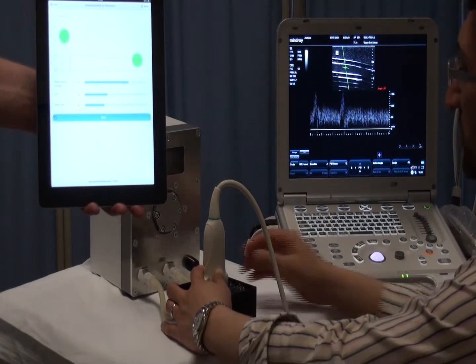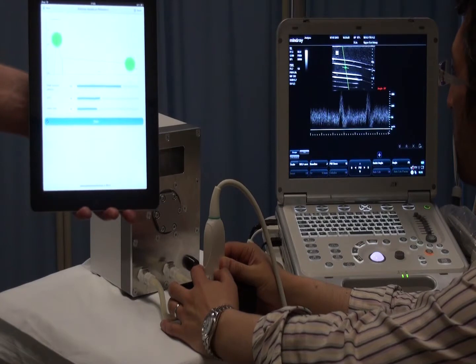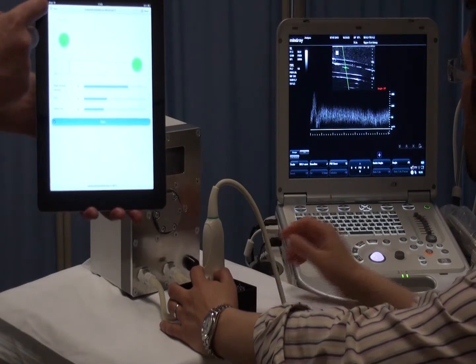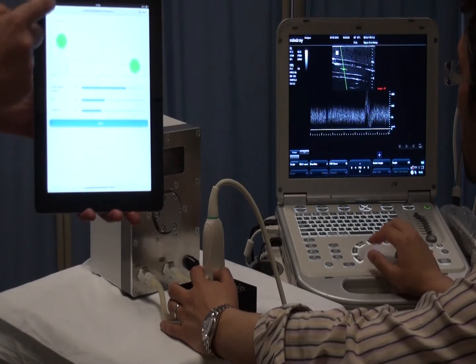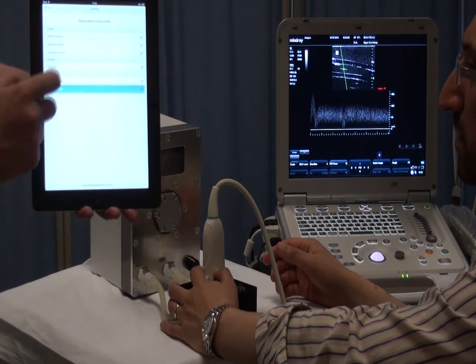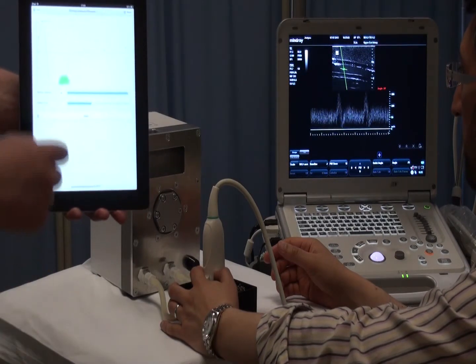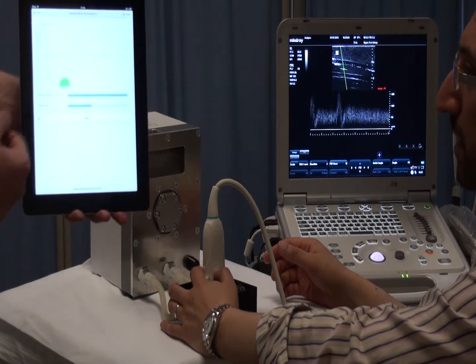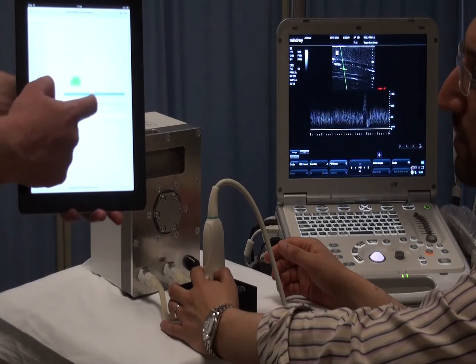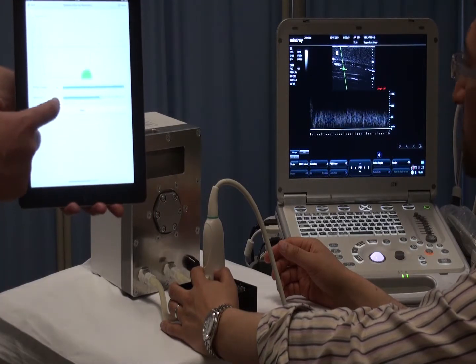Okay, just one last demonstration. Can we see reflux, for instance, in a superficial vein? Let's set that up. Alright, we're going to have a reflux time of perhaps, what, 3 seconds? Very good. And we'll send that waveform.